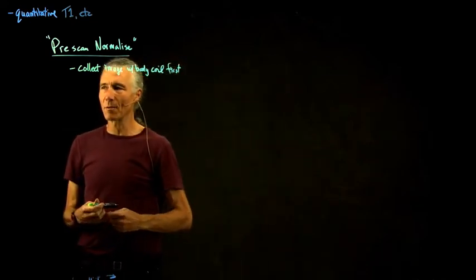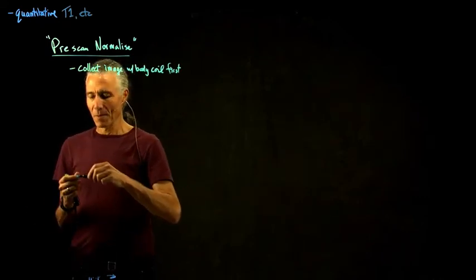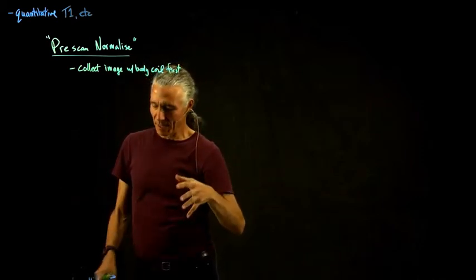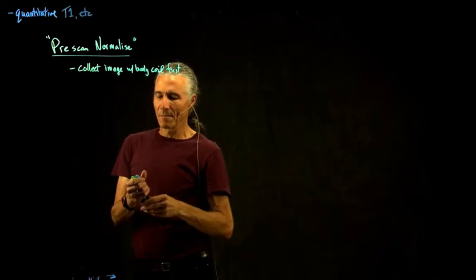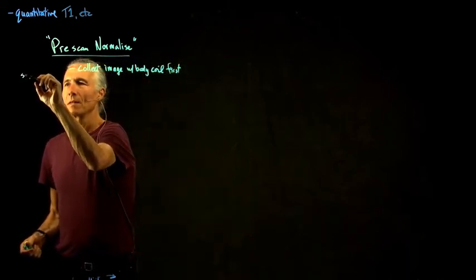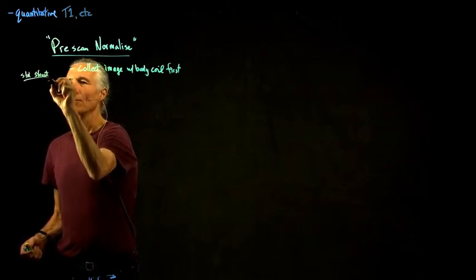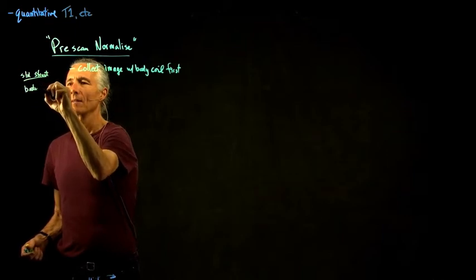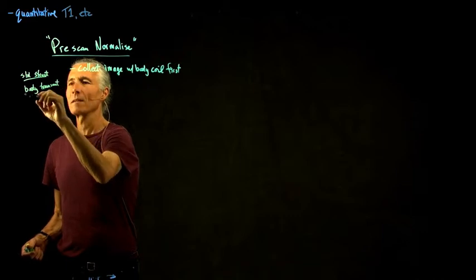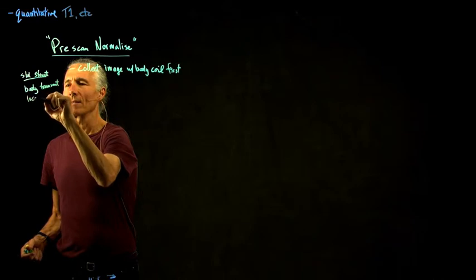The goal is to correct for the coil fall-off problem. If you collect with the body coil, it is far away, so the signal isn't very good, and so typically, for a standard structural scan, you would do body transmit and local coil receive.